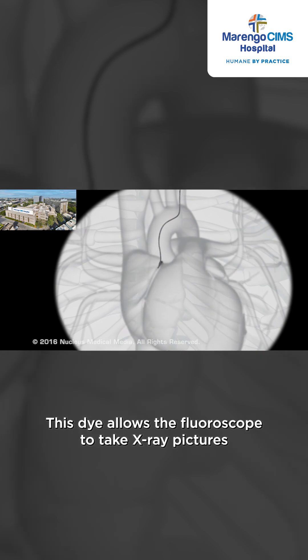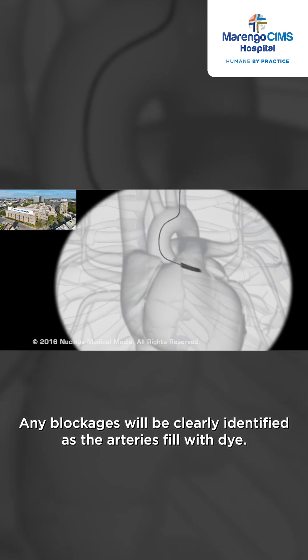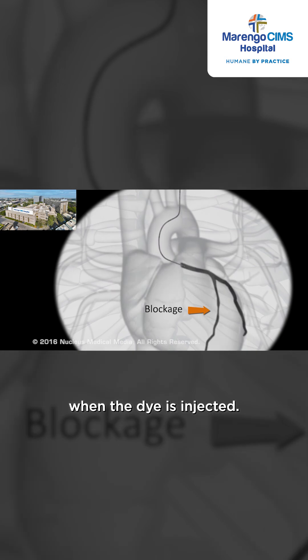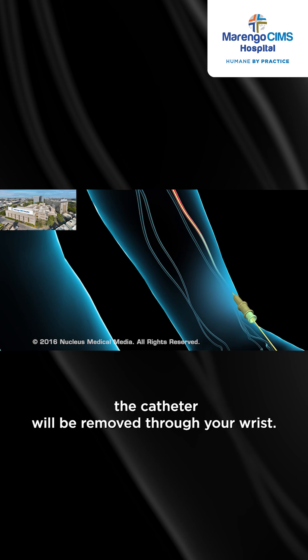This dye allows the fluoroscope to take x-ray pictures of your arteries, called angiograms. Any blockages will be clearly identified as the arteries fill with dye. You may feel flushed or slightly nauseated when the dye is injected. At the end of the procedure, the catheter will be removed through your wrist.